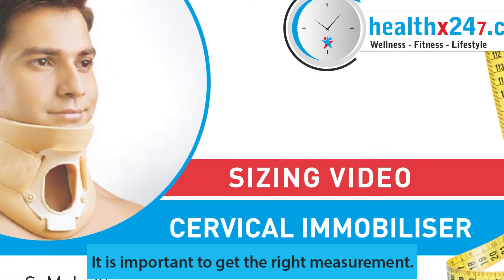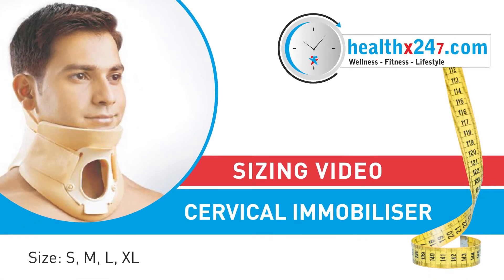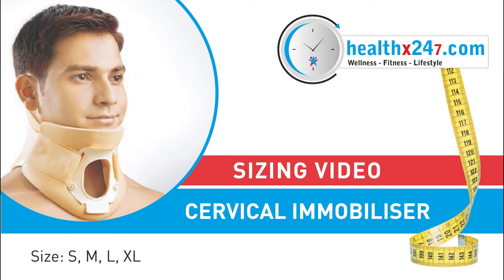It is important to get the right neck measurement. This video guide will help you select the correct size for your neck.